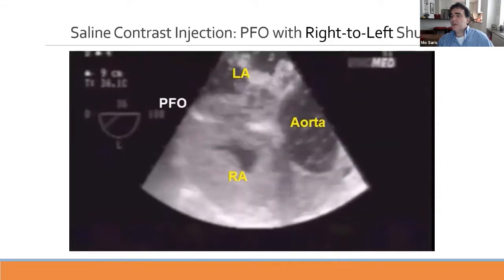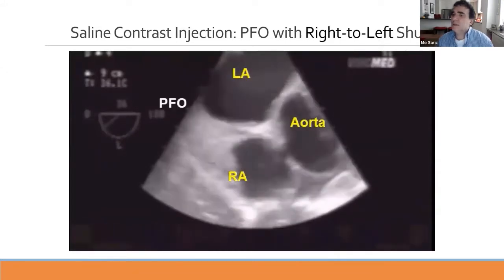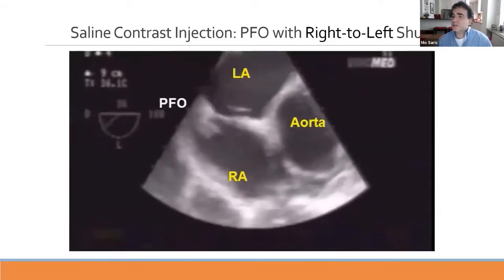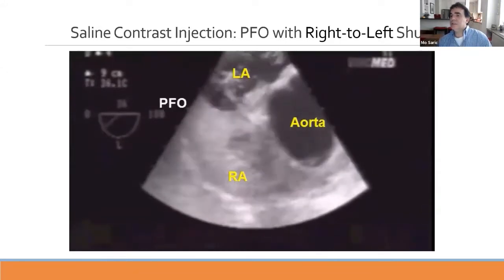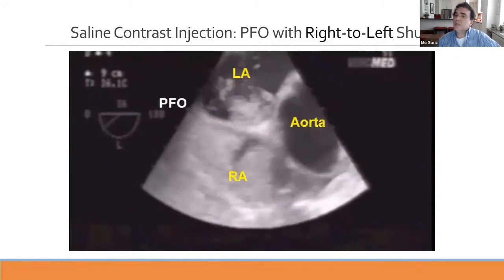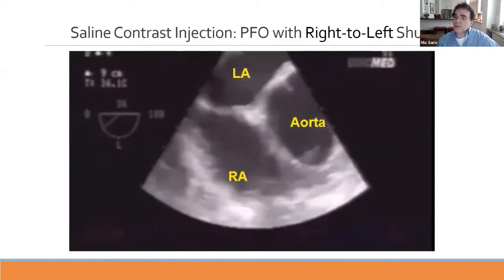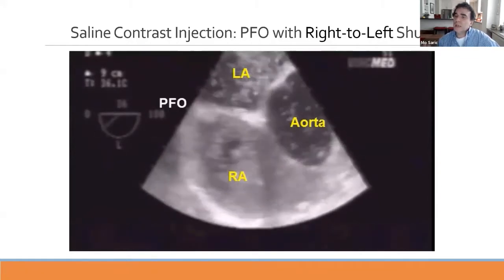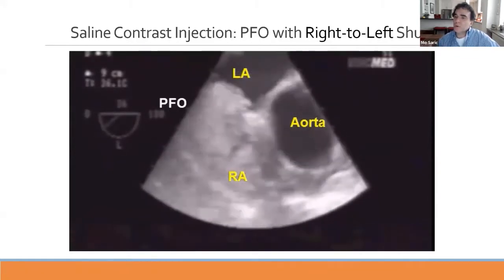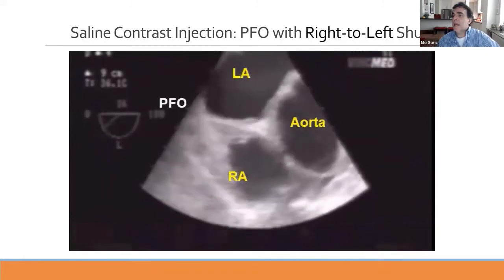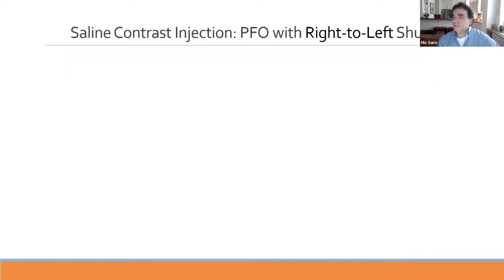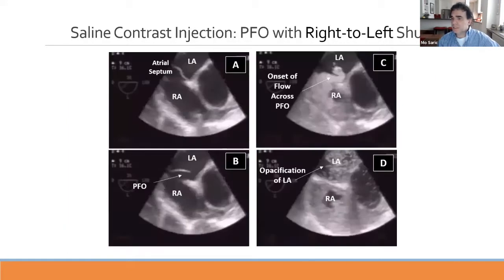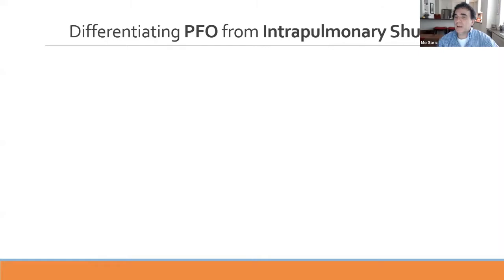From the guidelines, this is a pediatric population example showing a large number of bubbles crossing the PFO in an intermittent bolus fashion. These are still images of different phases in a patient with a tunnel-type patent foramen ovale.